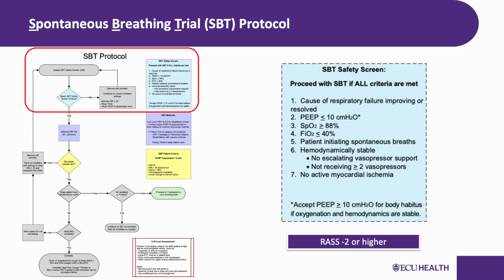If the RASS is deeper than -2, work with nursing on the timing of the sedation awakening trial and sedation adjustment to get that threshold before completing your spontaneous breathing trial. If the patient is off protocol, get an order from the team and discuss the sedation plan as part of that conversation. No patient should go unscreened, and no SBT happens without confirming the patient is at a RASS of -2 or better, and no trial proceeds without proper coordination or authorization. Screen, review the RASS nursing has documented, confirm -2 or better, communicate, and then trial.